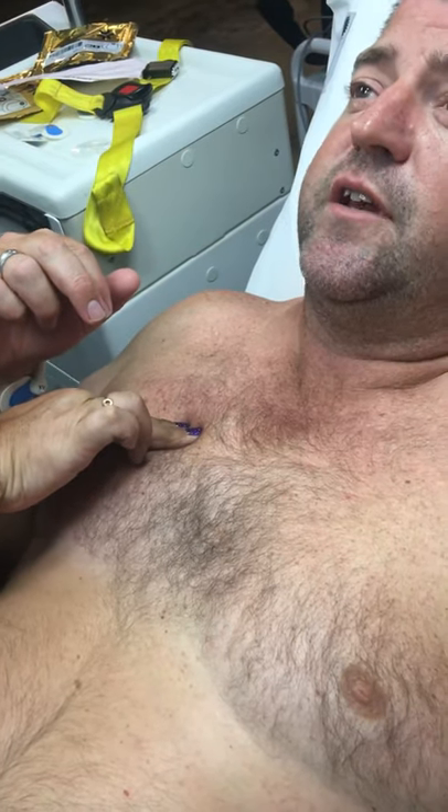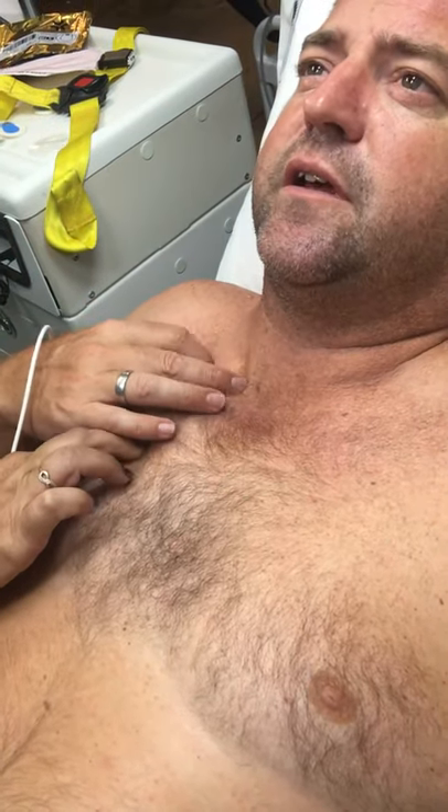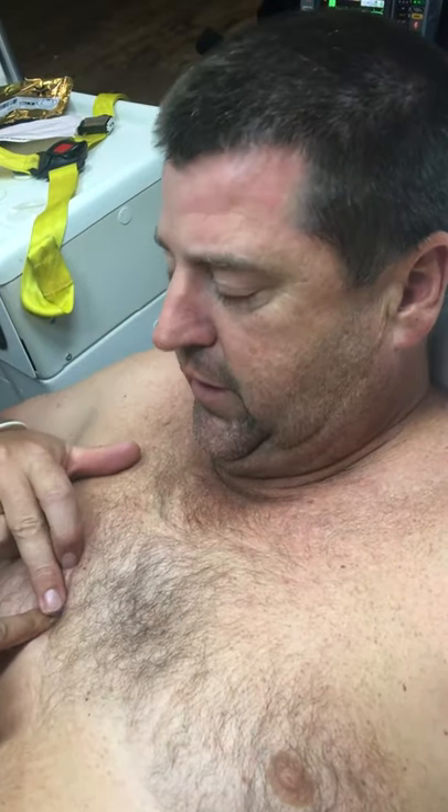Can you feel the second space? Second intercostal. Next one — that's the third. Next one again — that's a space. Fourth intercostal space. So V1 goes right sternal, fourth intercostal space, right sternal border. The centre of the dot needs to go right where your finger is — I'll hold it on there while you pull the backing off. Doesn't matter whether the knob faces top or bottom.